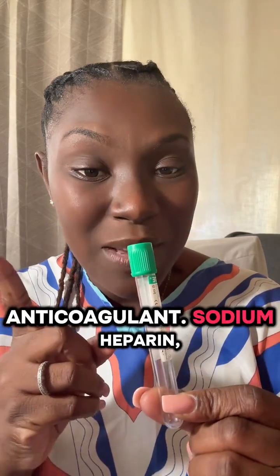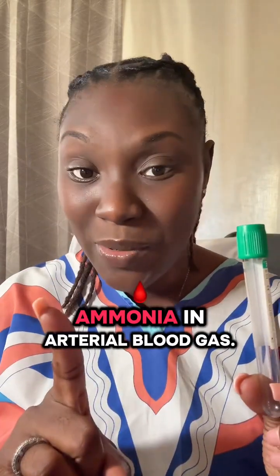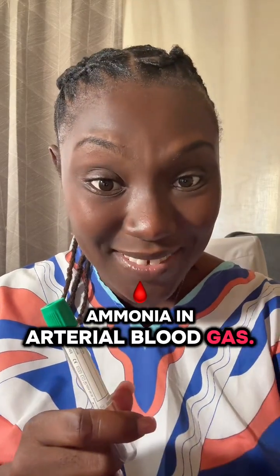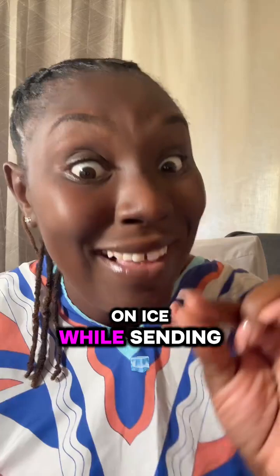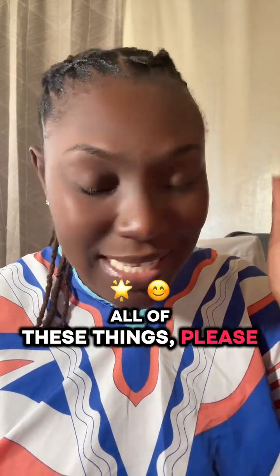This tube here, anticoagulant, sodium heparin, lithium heparin. Important tests, remember them: ammonia and arterial blood gas. Funny thing, both of those tests need to be chilled on ice while sending it to the lab. All of these things, please remember them.